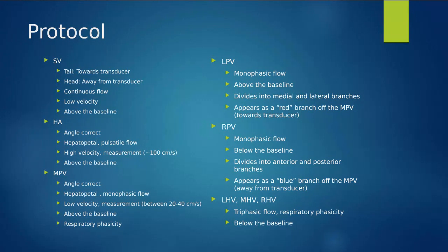And typically for cirrhosis, whether it be acute or chronic, we can see main portal vein flow reversal. We could see low main portal vein velocity. We could see increased pulsatility of the main portal vein, and we could see turbulent color pattern when we are just using color Doppler on that main portal vein. So the cirrhosis is mainly going to be affecting that main portal vein.